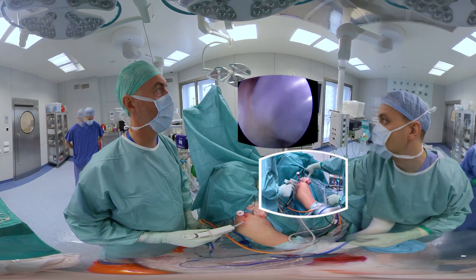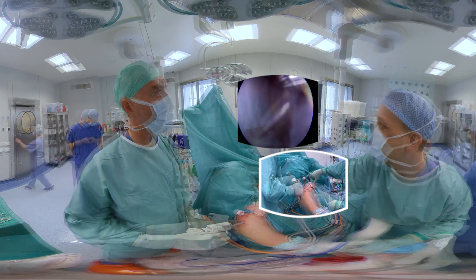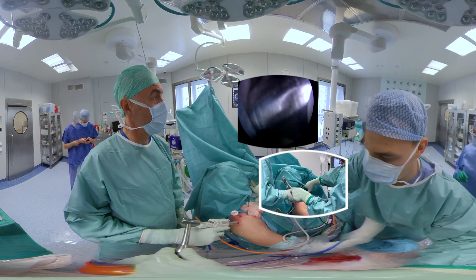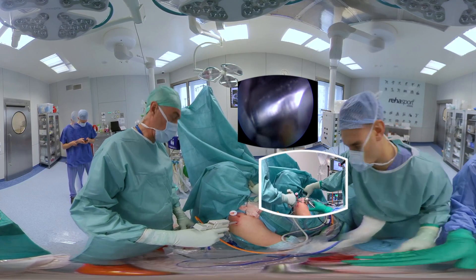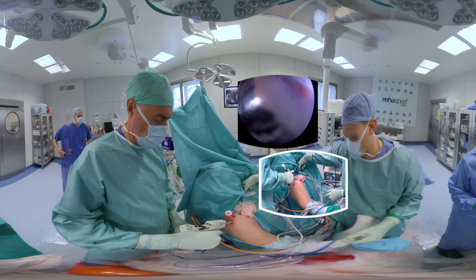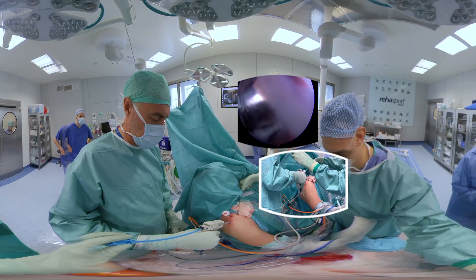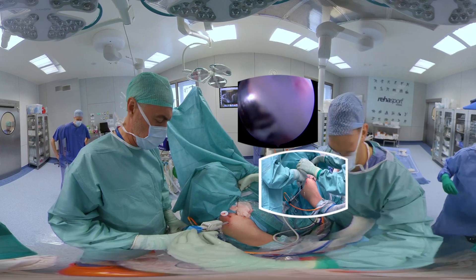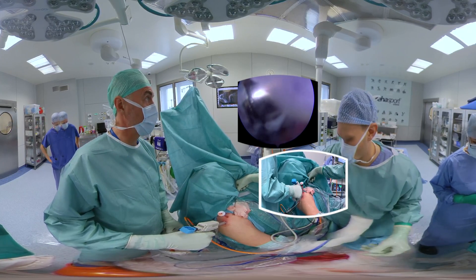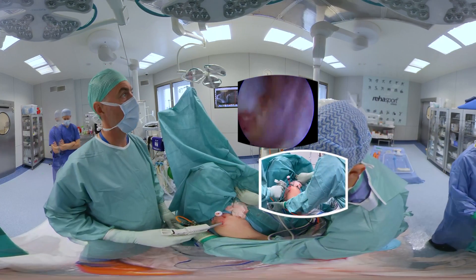Finally, the membrane is fixed to the bone laterally. A bone anchor inserter is introduced via the lateral portal. The sheath is retracted by release of the slide lever, revealing the metal pins of the bone punch. Pins are pressed through the membrane against the bone and then impacted with the mallet until fully seated. After squeezing the trigger, the bone punch is released and replaced with the peak bone anchor inserter. Once in place, it is slightly tapped until flush with the membrane.